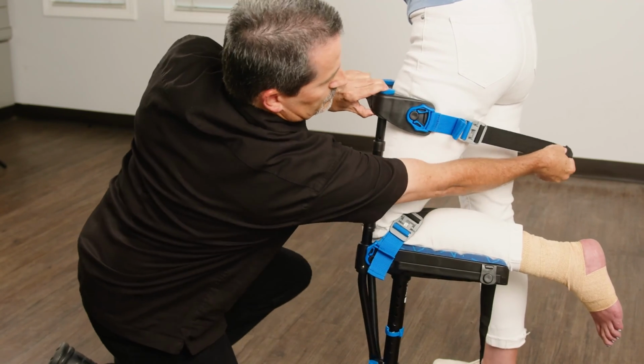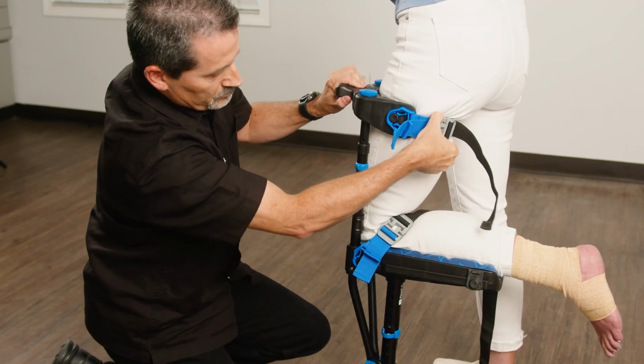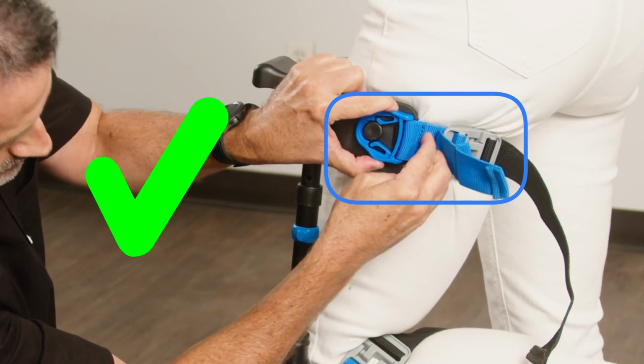Tighten the strap by pulling on the tail of the black webbing. Then, cinch the strap tight using the blue section. Check to make sure your adjustments are correct.